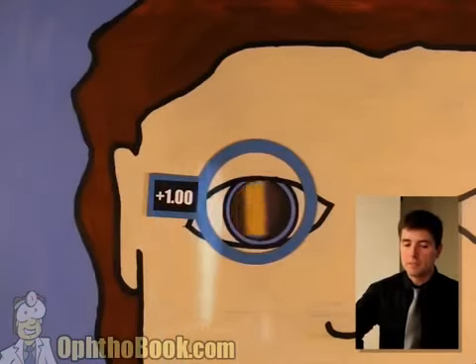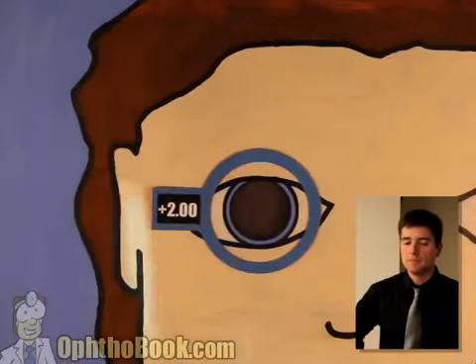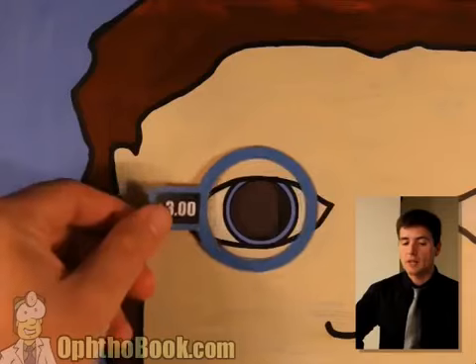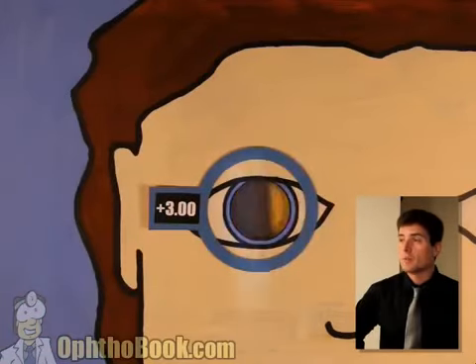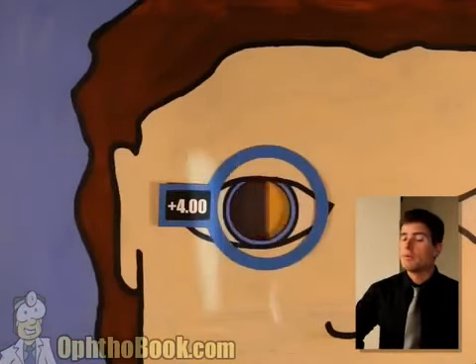So let's add a +1. No, it's not quite there yet. Let's add another one. I'm getting closer. Our reflection's getting larger. Let's add another one. I think we got it. Perfect. Am I getting greedy? I am getting greedy. Let's try it. No, we've gone too far.